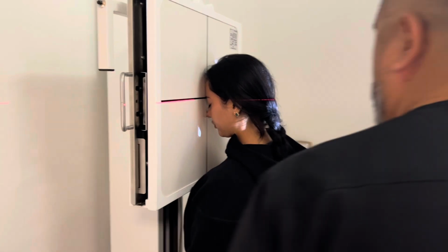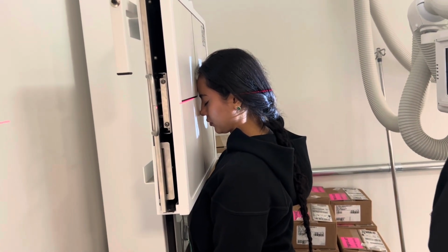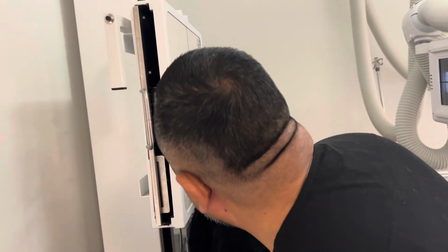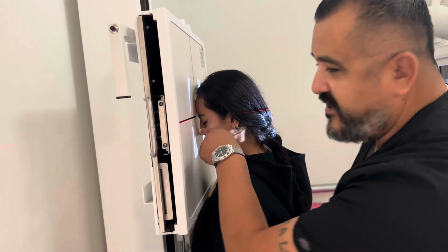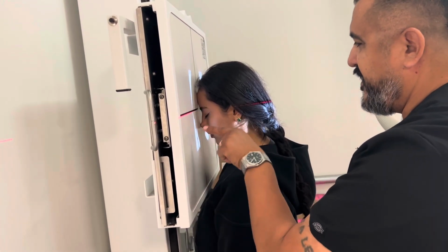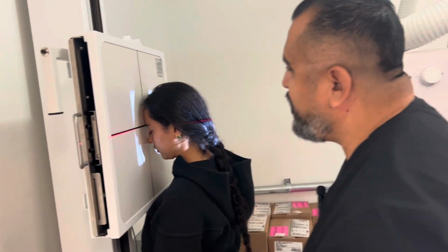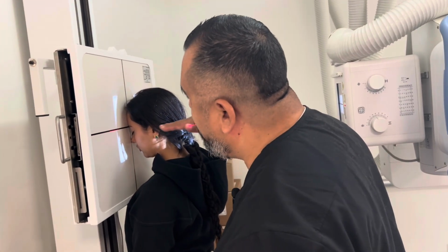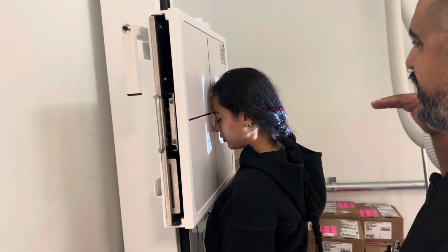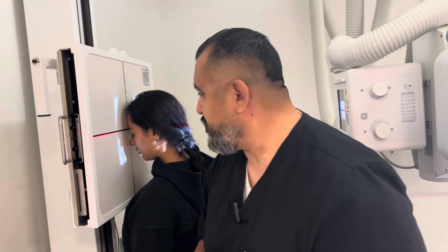Okay. I'm going to open this up just to the area of her frontal sinus. And this is pretty much going to be it here. So it's going to be exiting the nasion here. And we're going to put the left marker down here, face down. And this is your Caldwell. So it's pretty much a PA. The OML would be about 15 degrees from the horizontal plane. But again, your central ray is perpendicular. Why? Because you're checking for air-fluid levels, okay?